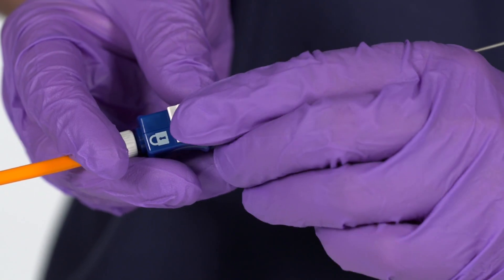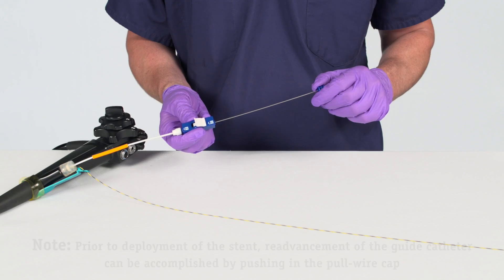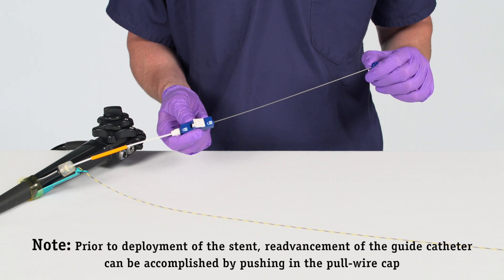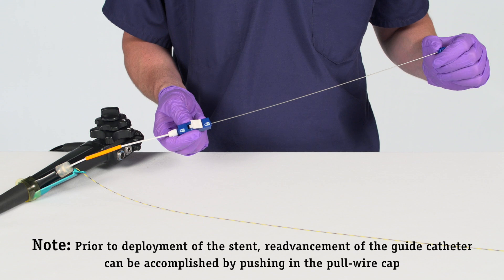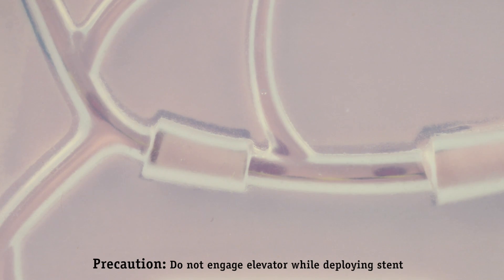Unlock the Naviflex RX Delivery System Locking Mechanism. Advance the stent into the desired location in the duct using the push catheter. Simultaneously, maintain the guide catheter RO marker position in the desired ductal location by retracting the guide catheter. Continue advancing the delivery system until the endoscopic marker on the trailing end of the stent remains visible outside the papilla.